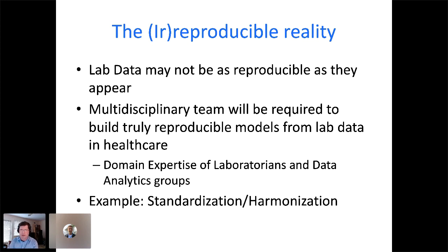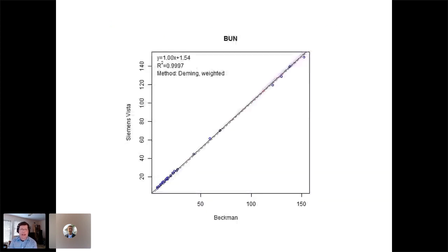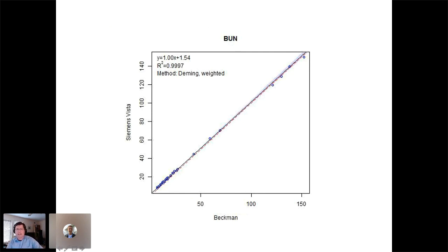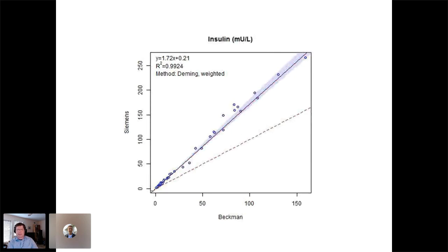Let me give one example using standardization or harmonization. The next few slides are actual data from a crossover study I did several years ago, moving from a Beckman set of instruments to a Siemens set of instruments. The world typically assumes everything works like BUN — blood urea nitrogen — where the slope is one, the intercept is very close to zero, and everything matches up nicely with the unity line. The reality is that for many assays, this is not the case. Here's insulin on those same two instruments — if you look at the dotted unity line, the actual relationship between the instruments has a slope far above that, on the order of 1.7.